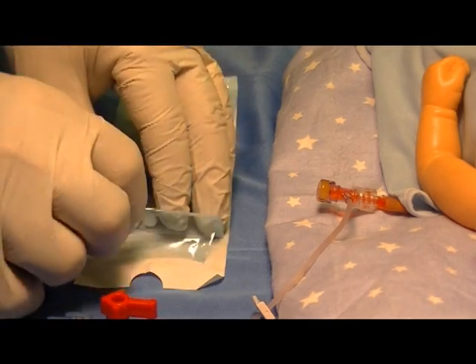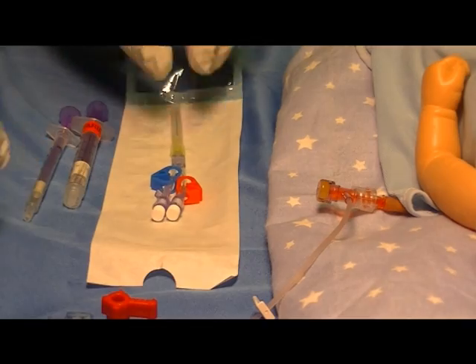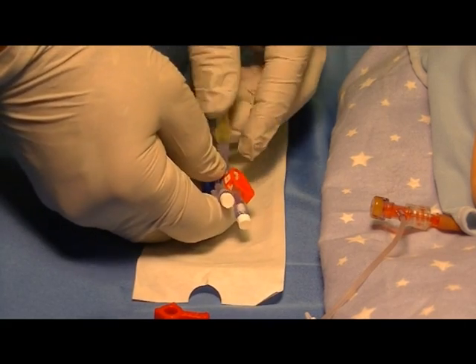Next you would open the Humi micro draw device and inspect it for integrity. Make sure the sterility cover is in place, the white vent plugs, and the clamps.